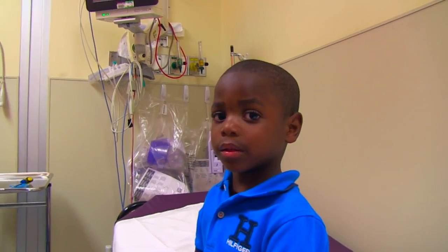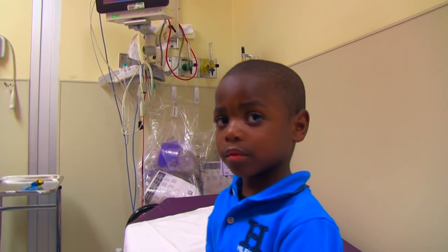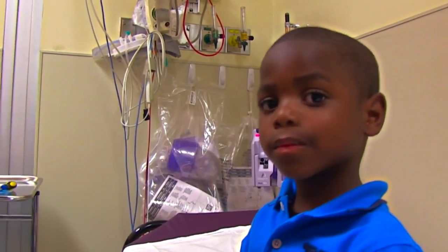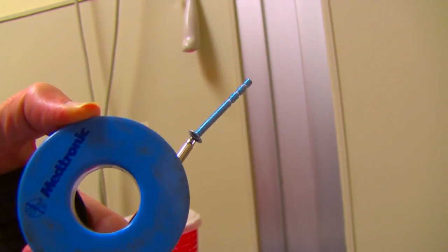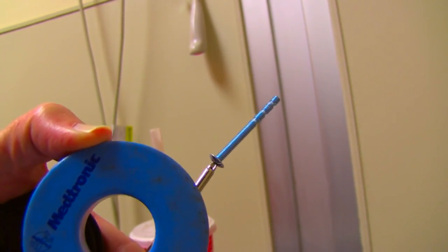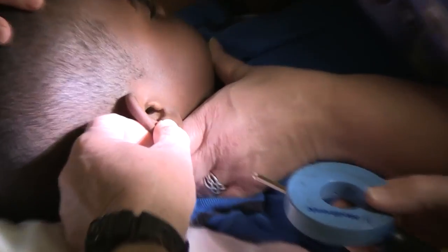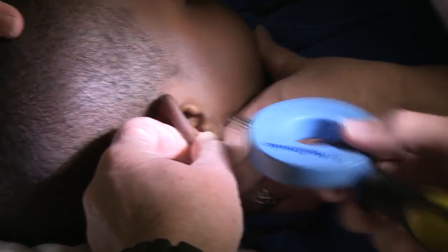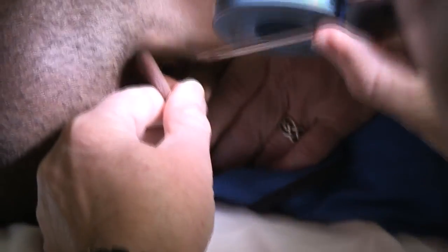How'd you get the screw in the ear? It came off a dinosaur toy. Here's our plan: we said we need something magnetized. We got the pacer magnet and put a screwdriver on it, and all of a sudden that screwdriver is magnetized. Just going to keep yourself still. I can see the shininess — you're going to feel it touching your ear.